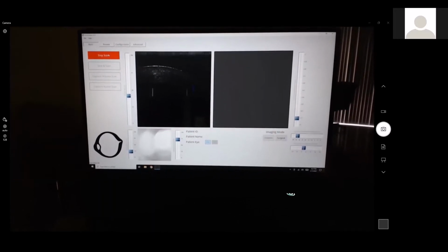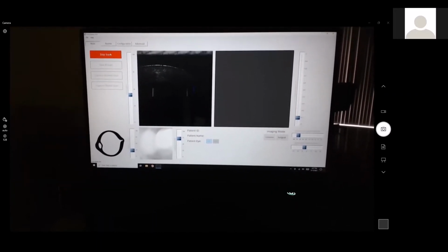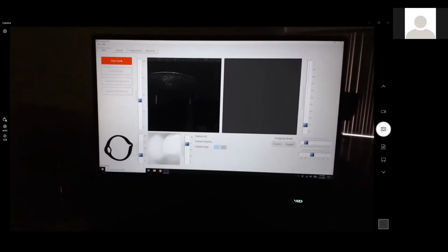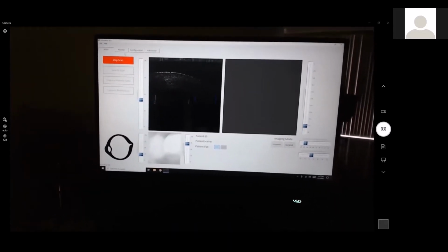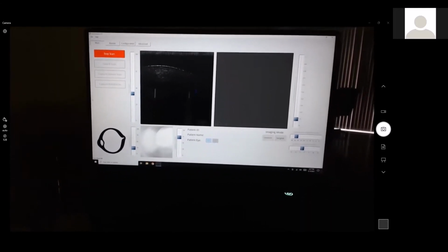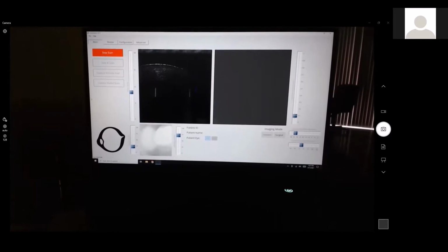So I suspect we could render this later on, not today, but with a little bit of time, we could rebuild that 3D of this cornea, because this is very nice, stable animal data. This is really very good. And this is clearly showing the benefit of doing sedated, seeing how stable everything is.